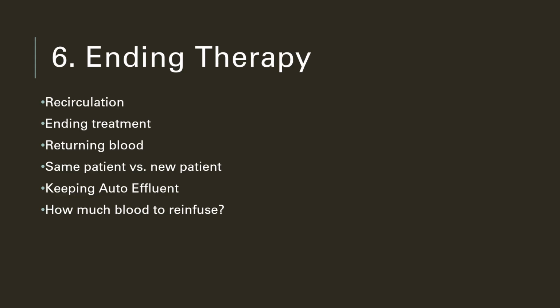If they're going to do the same patient new filter, while reusing the auto effluent, the nurse just must remember to take the 5-liter effluent bag that comes with the new filter set and prime into that. They should never attach the sterile blue line of the new filter to the dirty yellow port of the old auto effluent. There's instructions on screen to do this, but it's often missed.